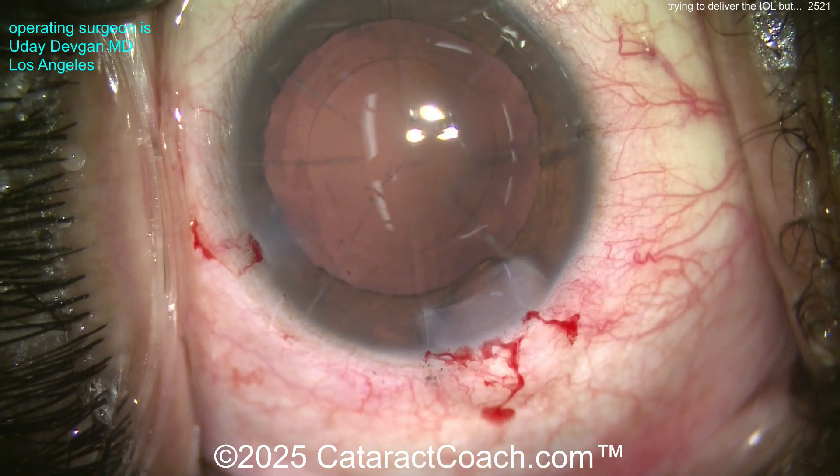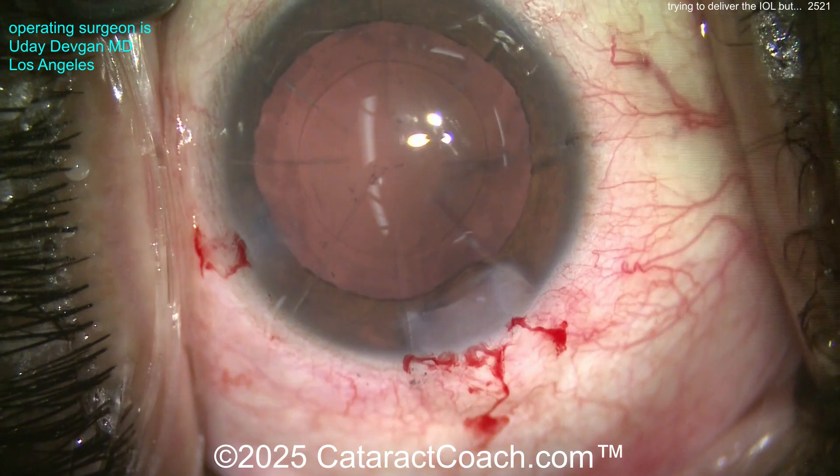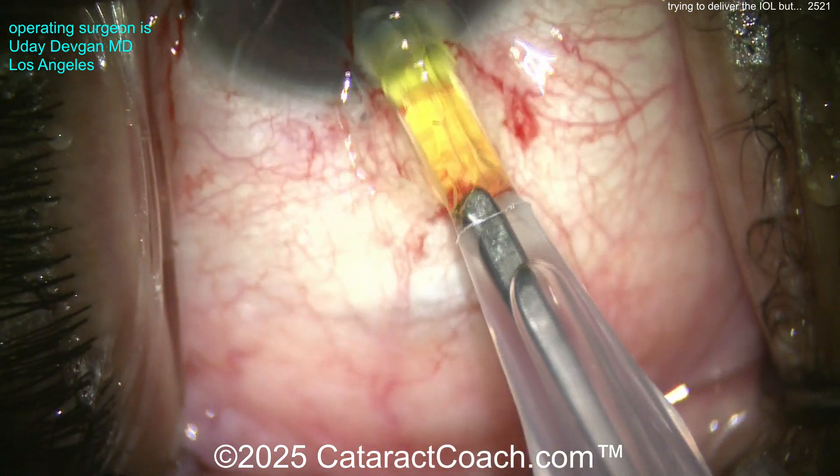At the end I'm going to try to put the IOL in the eye. This patient, like a lot of RK patients, had a big hyperopic shift later in life — the cornea is very, very flat. So the IOL power is very high, like 29 diopters.